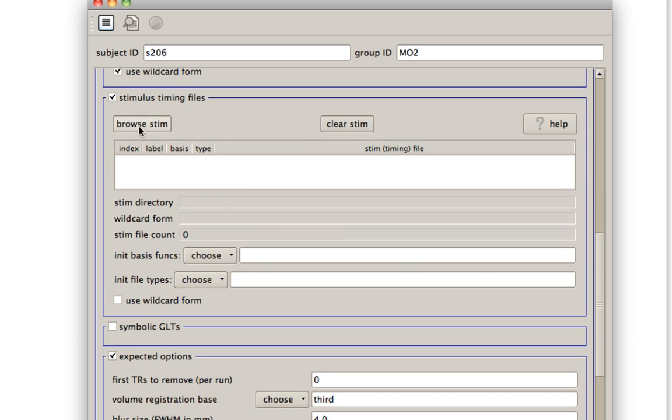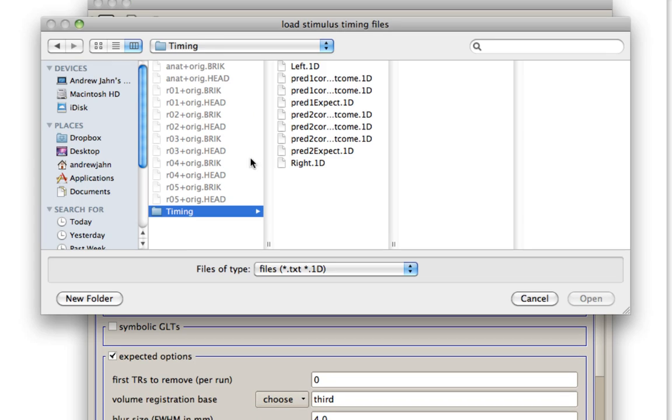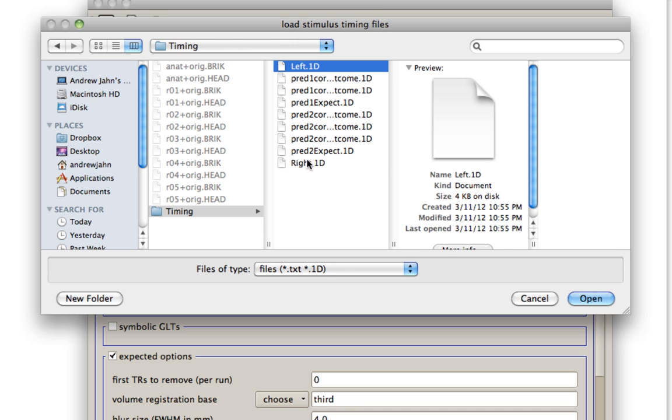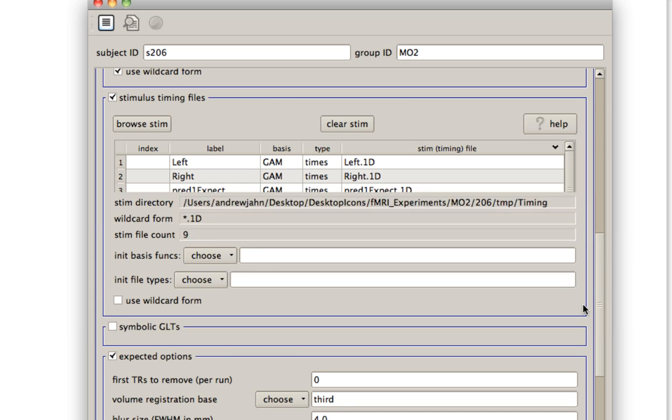Stimulus timing is similar. In this directory, I have this timing folder. I'm going to go ahead and select all of these different files. Again, wildcard form, that's fine if we want to use wildcard form because the only thing that's consistent across these is this .1d extension.